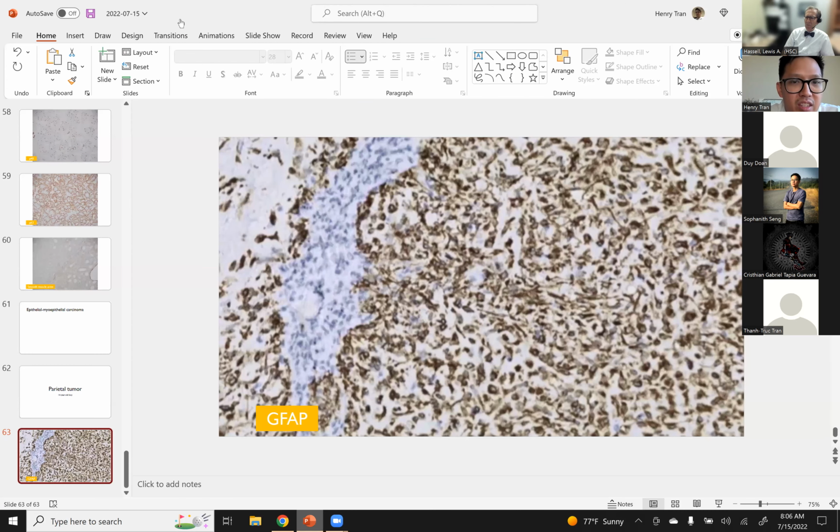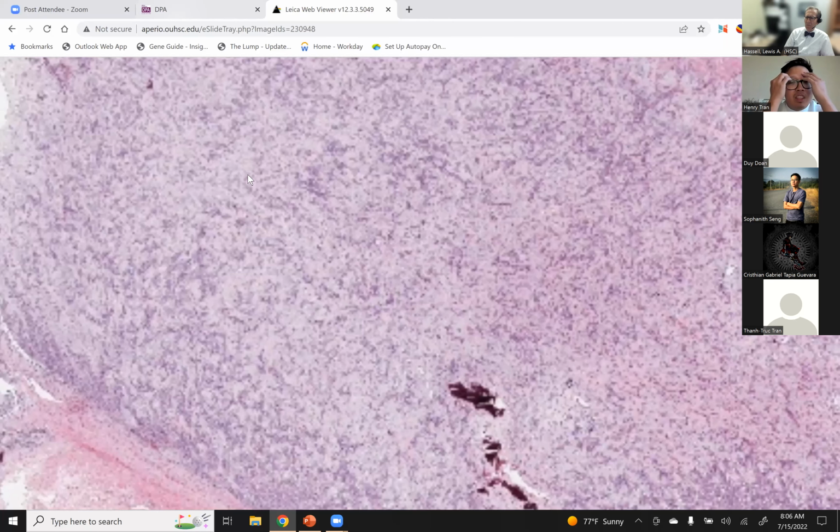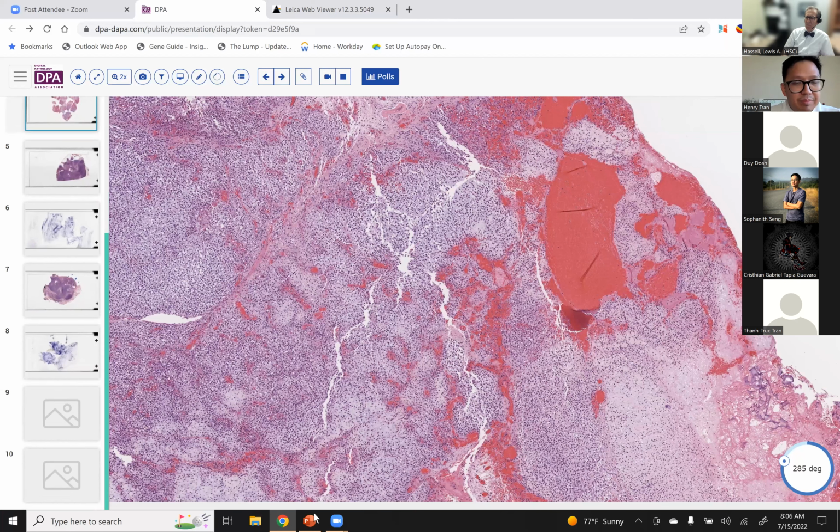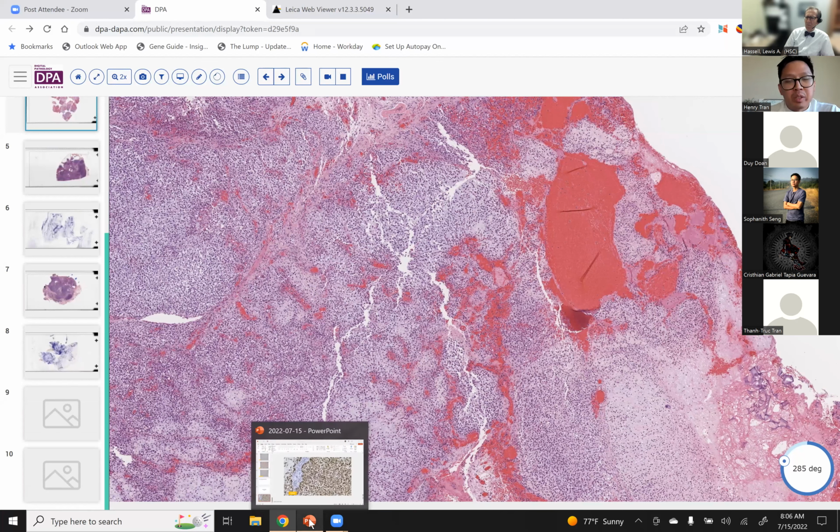So going back to this case, they ended up sending this in for molecular studies. I guess mesenchymal chondrosarcoma and myoepithelial carcinoma both have molecular findings. For myoepithelial carcinoma, that's the EWSR1 or FUS gene rearrangement, and mesenchymal chondrosarcoma is the NCOA2 translocation. Since I sent that in, I was hoping that maybe the gene panel would find it.